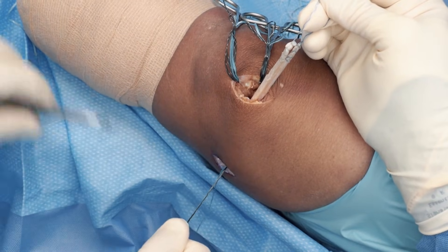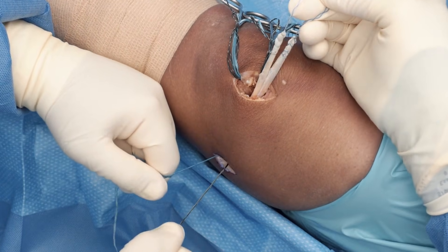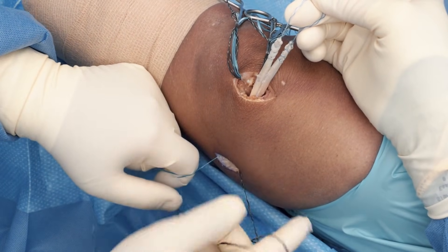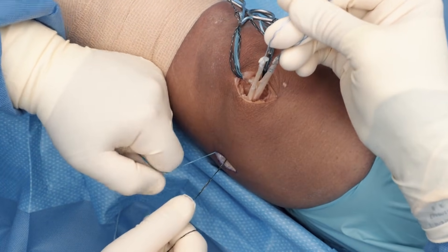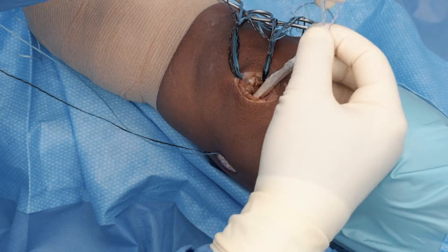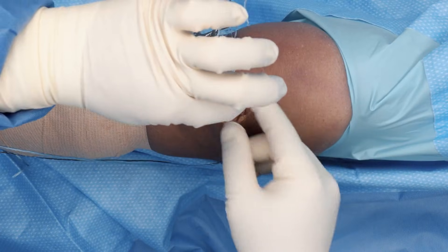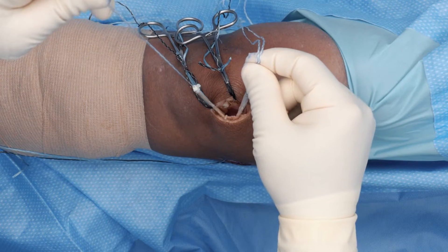I'm using a right angle here to help give me a little bit of counter traction as I sequentially cinch down the loops. I'll do a final pull, and you can see the graft is coming down to the femoral onlay position. I've pulled until I get full resistance, and I know that the anchor is fully set and the loops are cinched down. Now I'm going to pull on the two tails. Now that I have the femoral side fixed into place at the apex, I'm going to now secure the two tails of the graft.